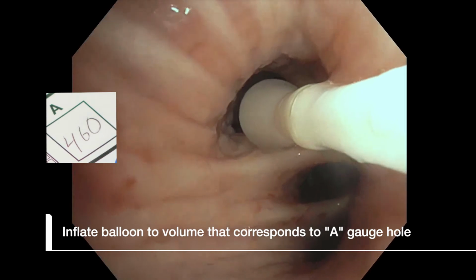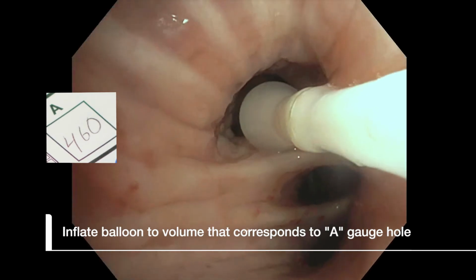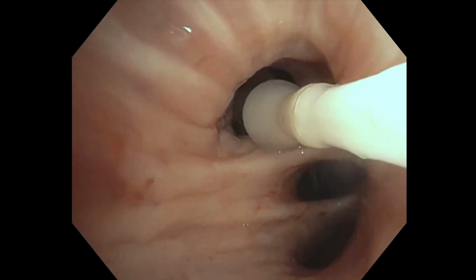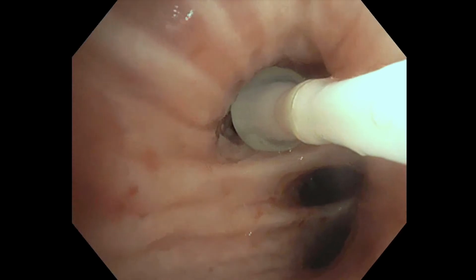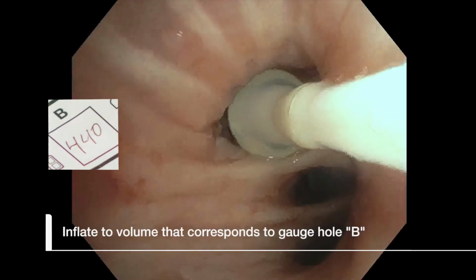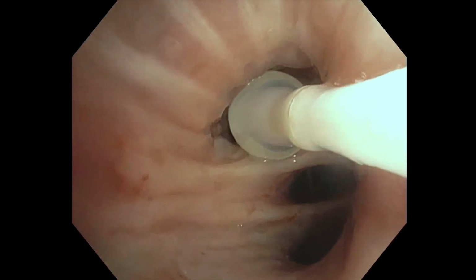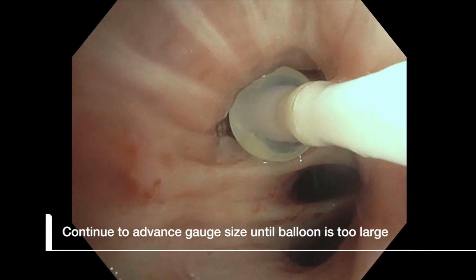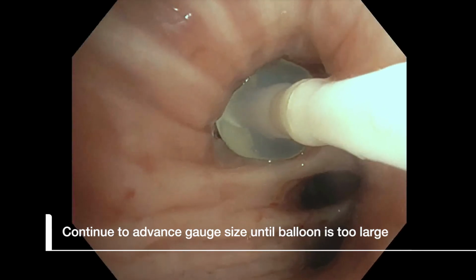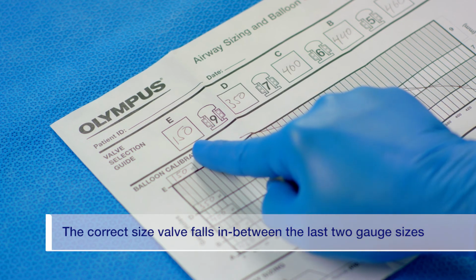Inflate the balloon to the volume on the syringe that corresponds to the A-gauge hole. If the balloon, when inflated to the A-gauge size, does not fully contact the entire circumference of the target site, inflate the balloon to the volume that corresponds to the B-gauge size. Continue advancing to the next larger gauge size until the balloon is too large or wedged in the airway. The correct size valve falls in between the last two gauge sizes.